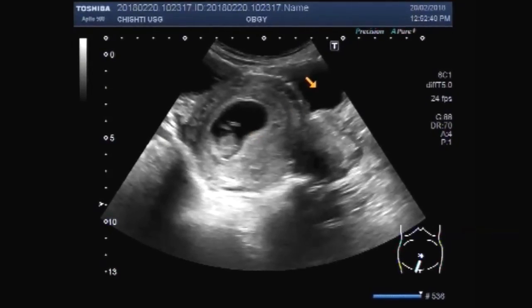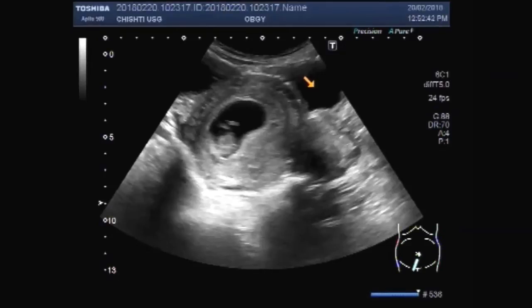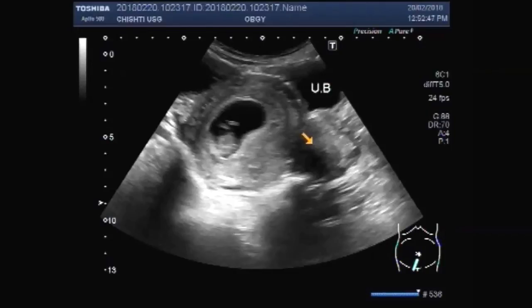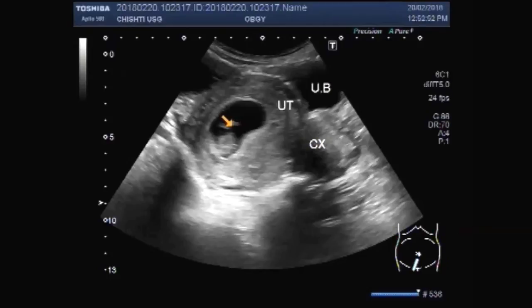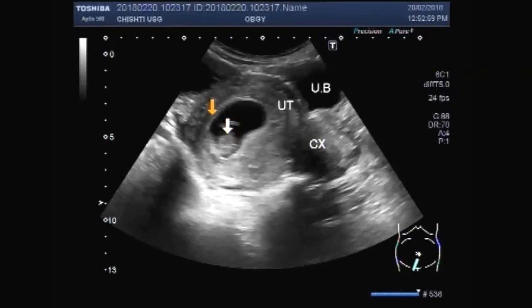This is the urinary bladder. This is the cervix of the uterus. And this is a small fetus in the gestational sac.